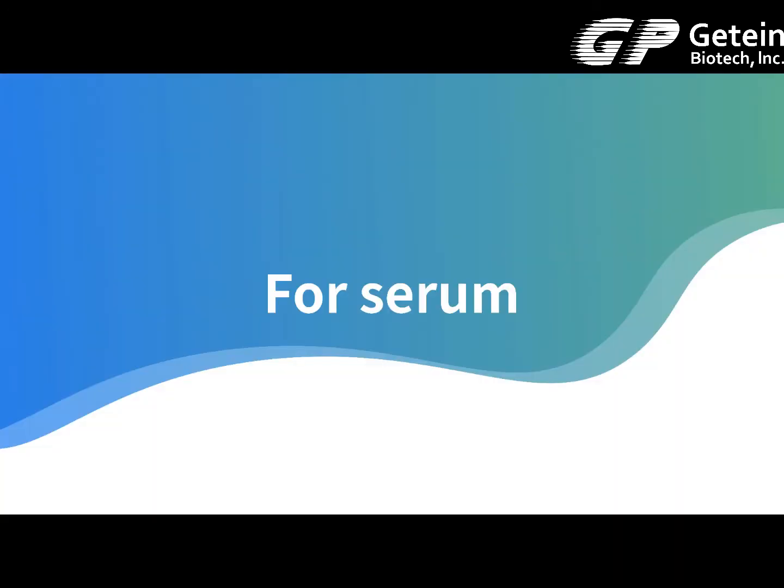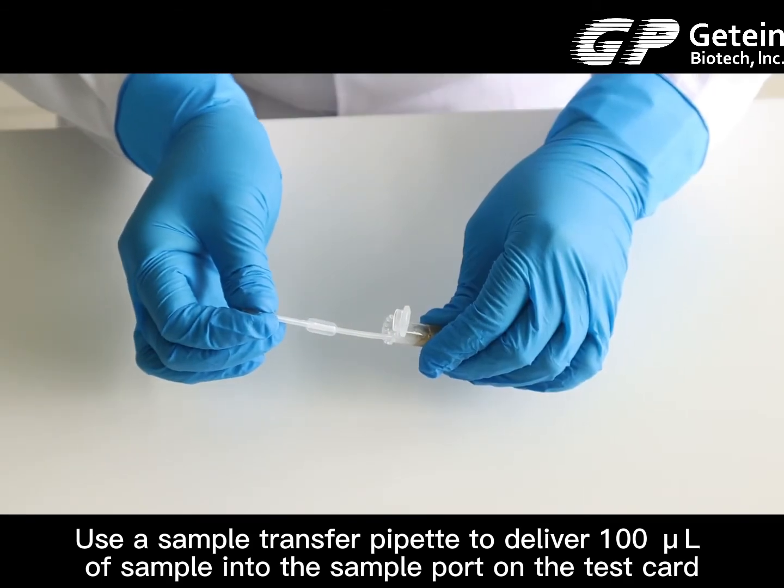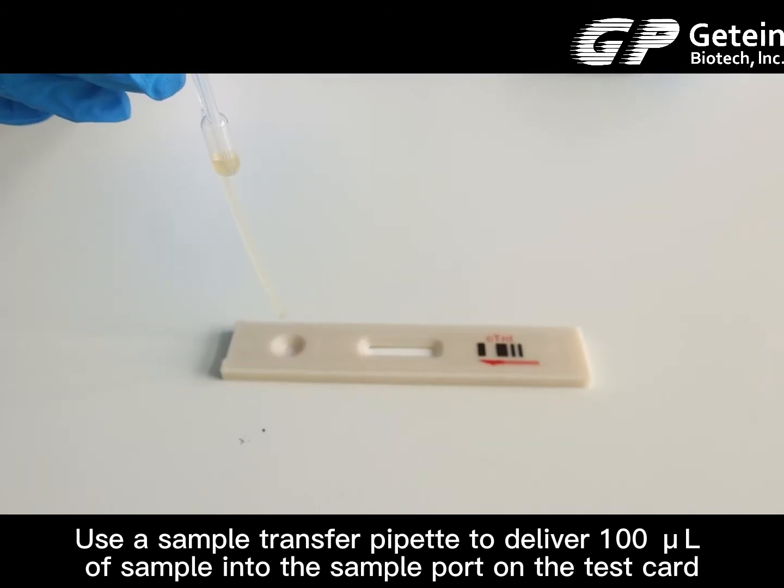For a serum sample, use the sample transfer pipette to deliver 100 microliters of the sample into the sample port on the test card.